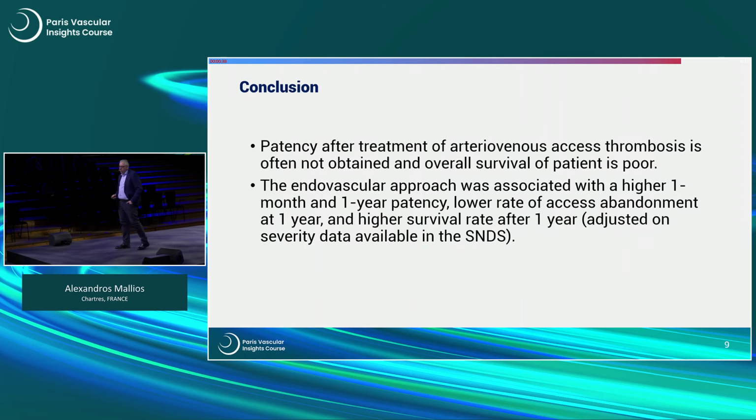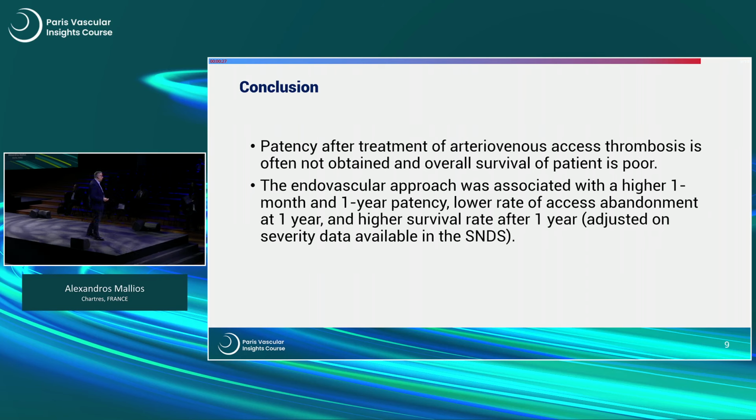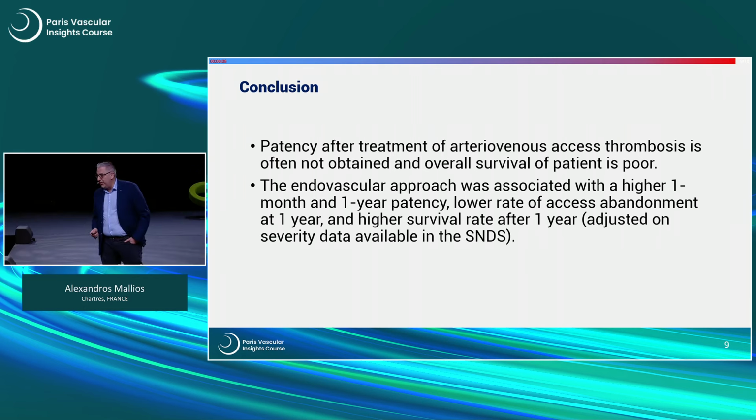So, in essence, to conclude, this study, which I think is an original study, is giving us some important evidence, which is that patency and survival are not the best for these patients, and lots of improvement can be provided. And the endovascular approach seems to be doing better in 1 year and 1 month patency. And there's definitely something that needs to be improved when we surgeons are doing thrombectomies without doing endovascular work. Thank you very much for your attention.